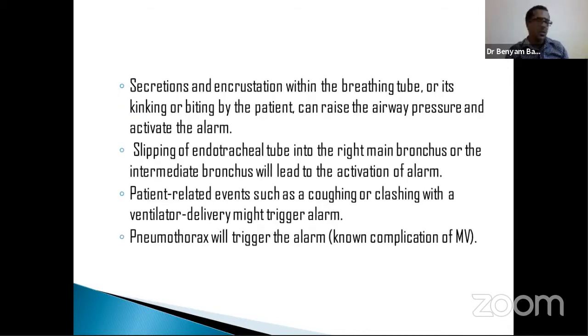So what can cause this high pressure alarm? Secretions are the most common cause. That is, there will be kinking or biting of the ET tube, or secretions obstructing the ET tube, which will cause the airway pressure to go up and the alarm to go off.